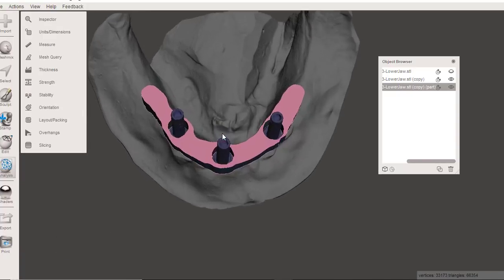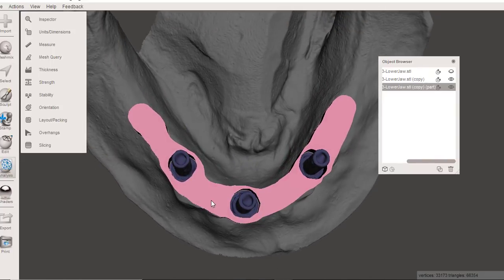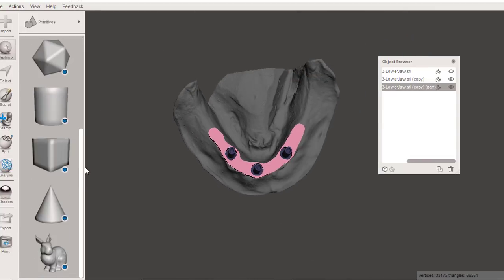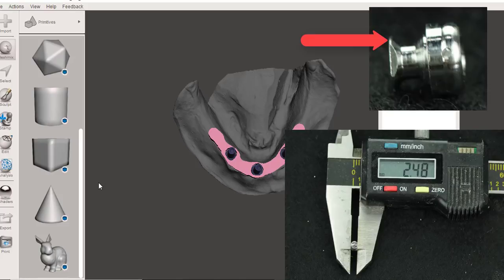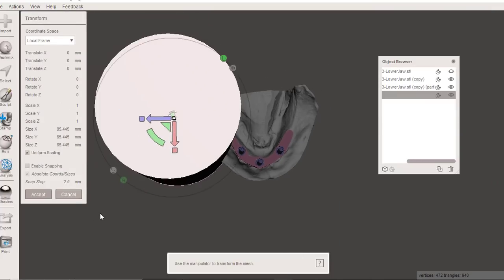Okay. The last thing that you could do if you wanted to do it is that you could go ahead and make your little slots to sink in the bar locators. And so if I wanted to, I could just grab some stock shapes here. I measured the nib of the wax in locators to be 2.5 millimeters. So I'm going to grab a cylinder, and when I pull this in, I just drop it into blank space over here, but it's a huge shape.